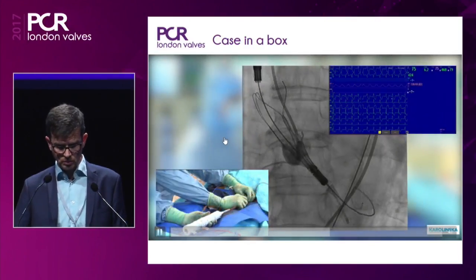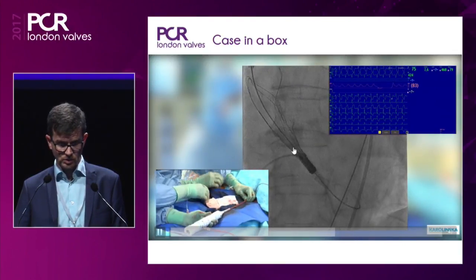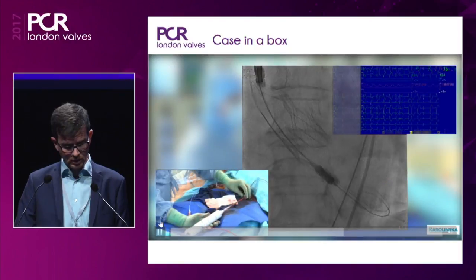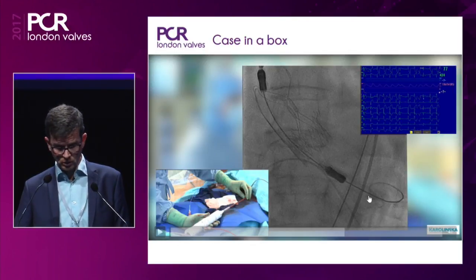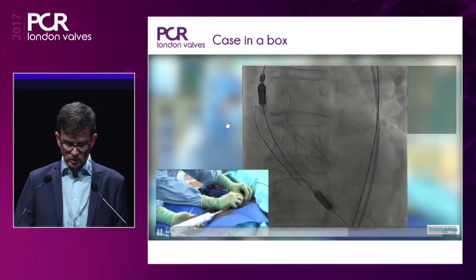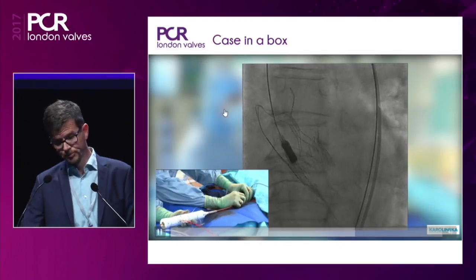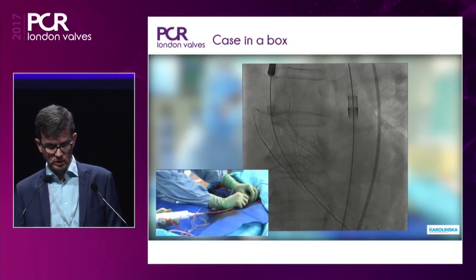We confirm the position and see we are in the same position as where we started. The implantation depth is about 7 millimeters. Now comes number two — my colleague removed the safety knob so we don't do this at the wrong moment. The valve flies open; the second capsule has been opened, pushing the nose cone a bit into the ventricle. Hemodynamics are stable throughout deployment. We're retrieving the system through the valve. Typically the delivery system is in the body around five minutes — a quite short procedure.